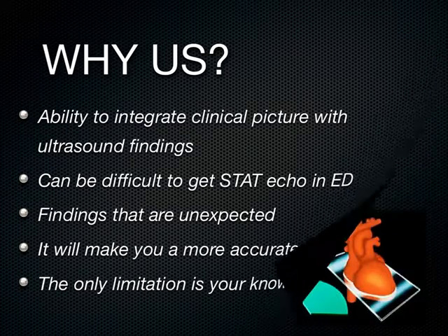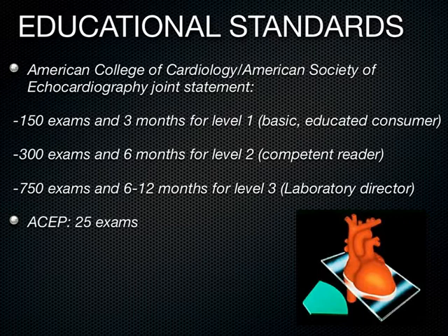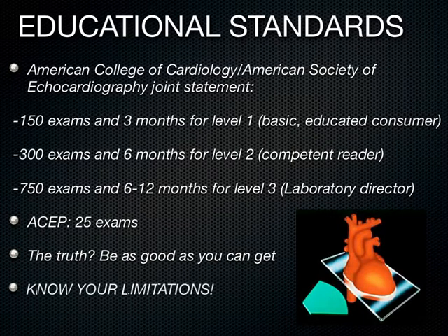So that's a good reason to be doing this stuff. There's all these educational standards out there from the American College of Cardiology and American Society of Echo, but the American College of Emergency Physicians wants 25 exams. The idea is you want to get as good as you can and start to understand some of your limitations with cardiac ultrasound, which we'll get to.